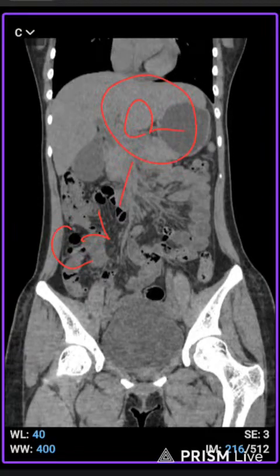After that, check whether the patient has any allergy to medication, as some patients have allergies to some types of medication. If the patient has that type of history, you have to prepare the medication. If there is an allergic history, you have to ask the radiologist.